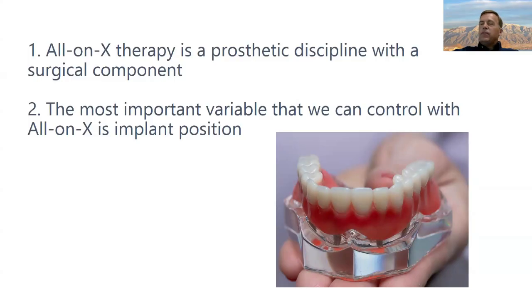And then the second thing is that there are, as you guys know, biologic problems that we can manage at best. But we have control over where the implants go and the alveoplasty, if necessary, that's done. So the restorative envelope that we create for the case, that we can control. And so we want to make sure that we are putting ourselves in a position for success by how we do that.